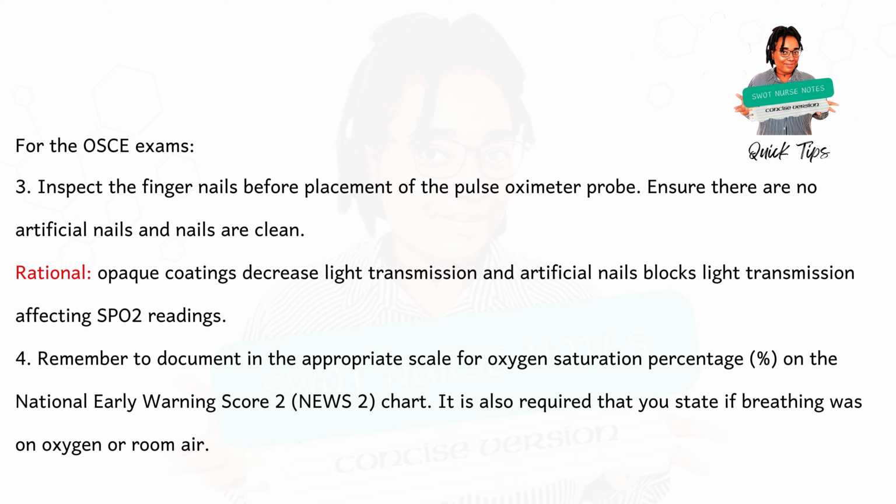Remember to document in the appropriate scale for oxygen saturation percentage on the National Early Warning Score 2 chart. It is also required that you state if breathing was on oxygen or room air.